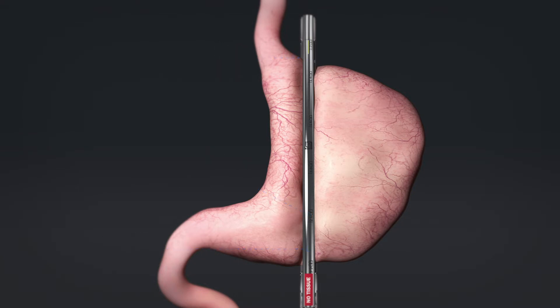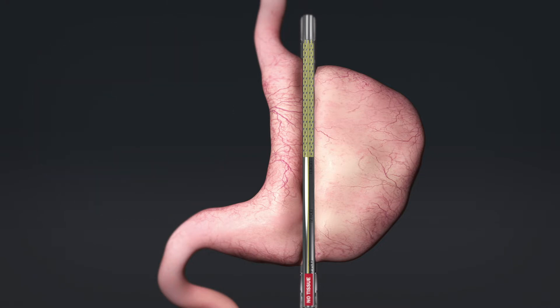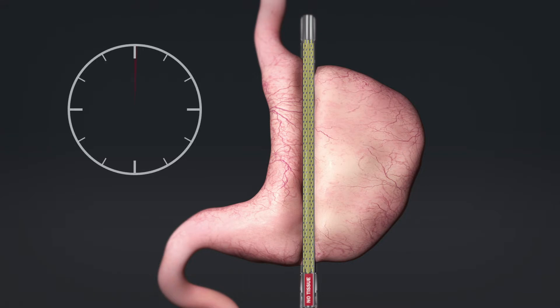From the top to the bottom, visualize the full cut line in a single plane. Fire the stapler. The Titan SGS continuously staples the entire length of the intended cut line with a single cartridge, delivering six staggered rows of staples in gastric tissue in less than one minute.